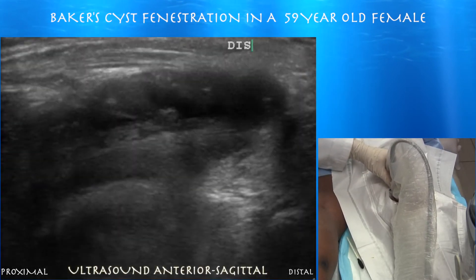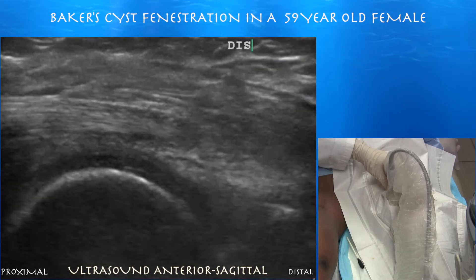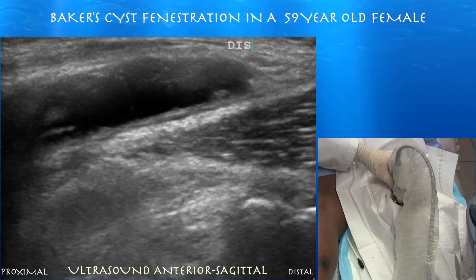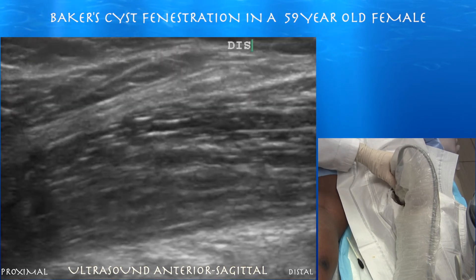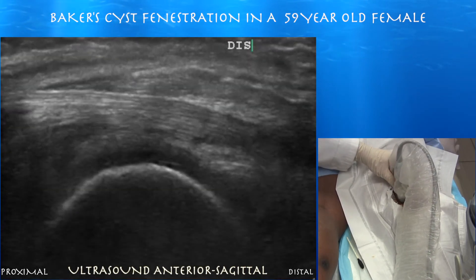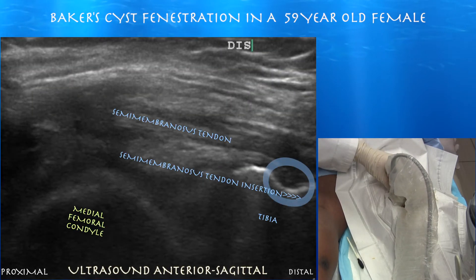Here's this large cyst right over the medial gastrocnemius muscle. You can see the semimembranosus tendon as we go medially — a quite thick tendon inserting on the posterior proximal tibia medially. There may be some debris within this Baker cyst as well, and you can appreciate the little sulcus where the semimembranosus tendon inserts.